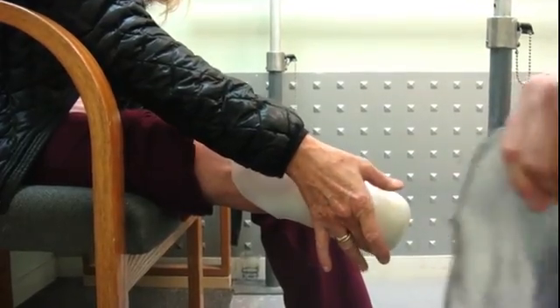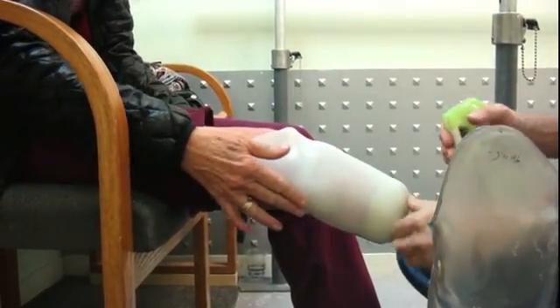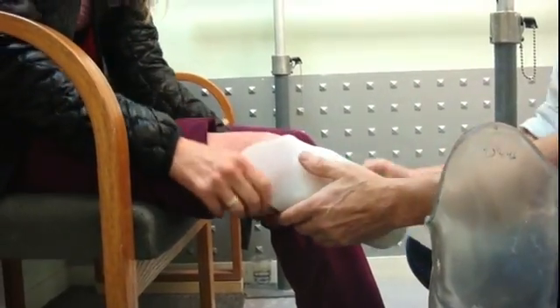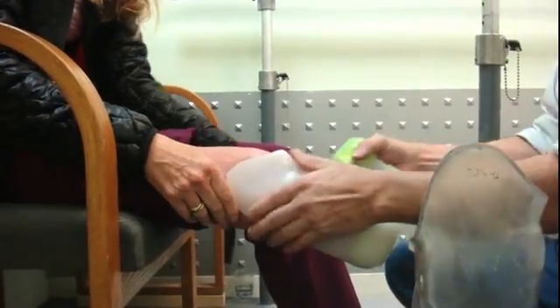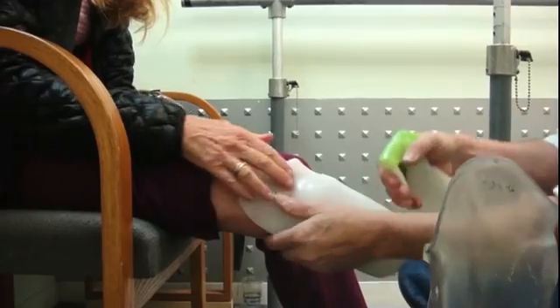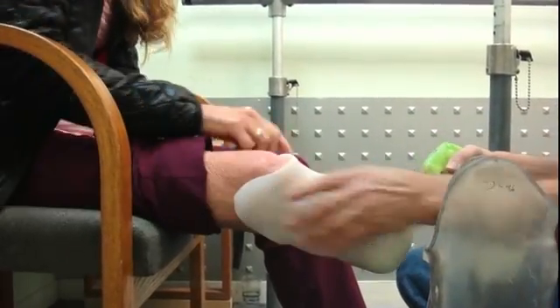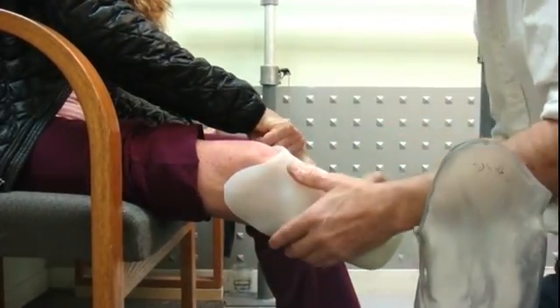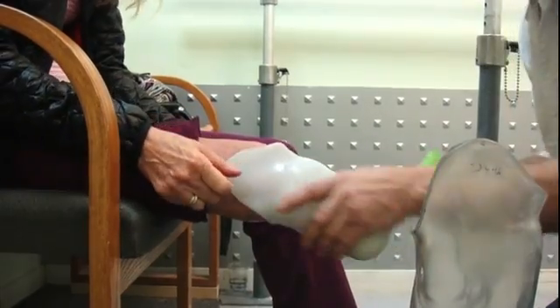This isn't on right. There's a sponge in the bottom, so don't worry about that. So you do it regularly with a sponge in the bottom? I think what we probably do when we do the final design is put the sponge on the other side. It goes up inside there.